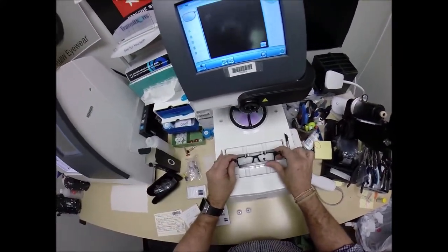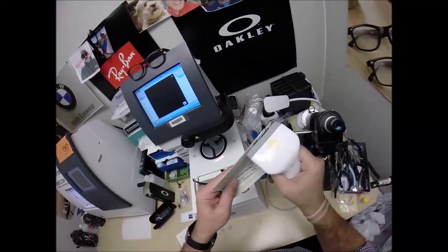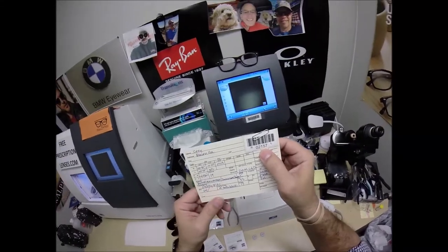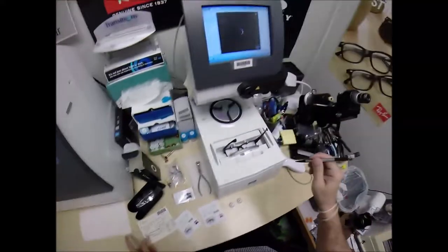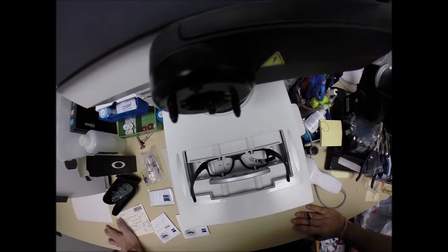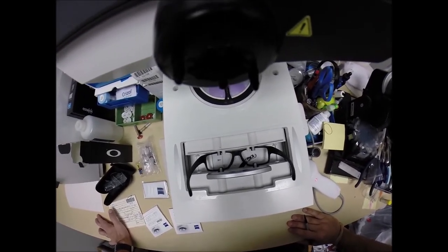I'll place the frame into the tracing element of my blocker and program the shape into the computer. You are secret agent 2157 — or, as I like to call you, volume 2147 of my 327 million volume series of making a pair of glasses for everyone in America. So stay tuned for those other 326 plus million videos. A little stylus is going to go around and trace the inside bevel of the right side of the frame before doing the same thing on the left, here at freeprescriptionlenses.com.